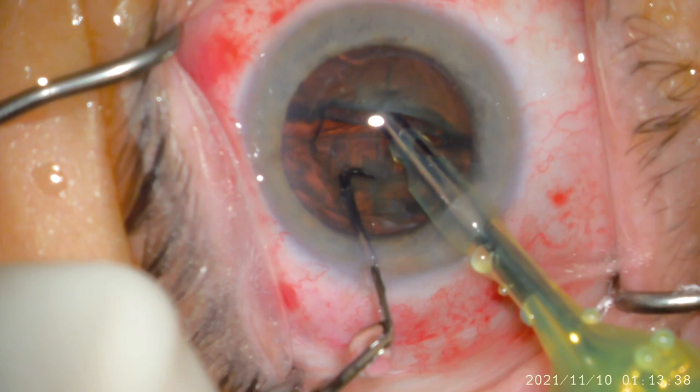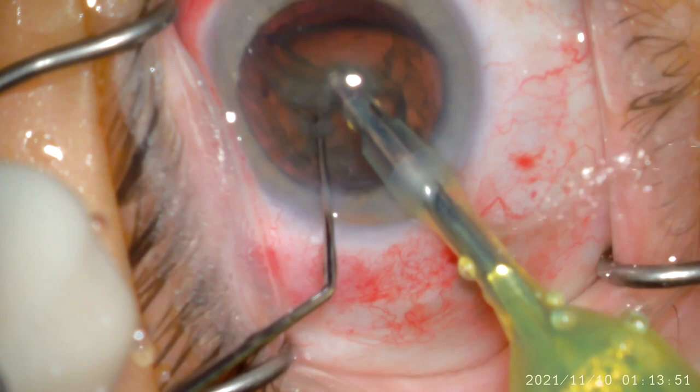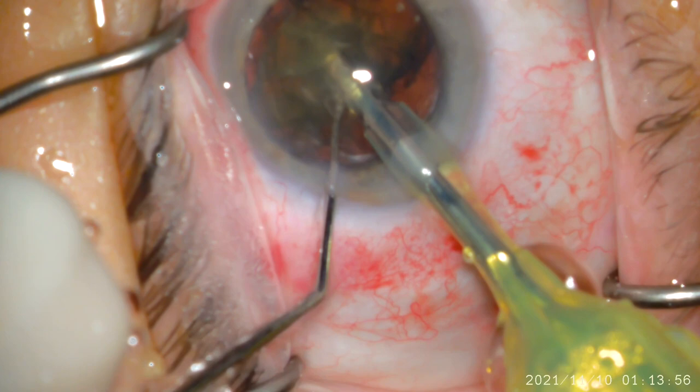Once the lens, aka the cataract, is broken up, I can use the tip of the FACO handpiece, along with the chopper instrument in my other hand, to break up the cataract into two. The smaller the pieces, the easier the removal, and the LensR system has already helped to make the breakup easier.